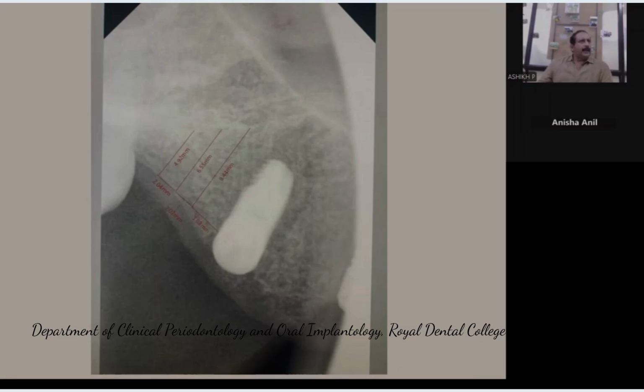You selected three lines. It's good one way you have done, because that's the way CBCT also gives you pictures. You have done, in your own IOPA, the initial planning as three lines, which corresponds to the implant diameter. Very good. So within those three lines comes your final implant.